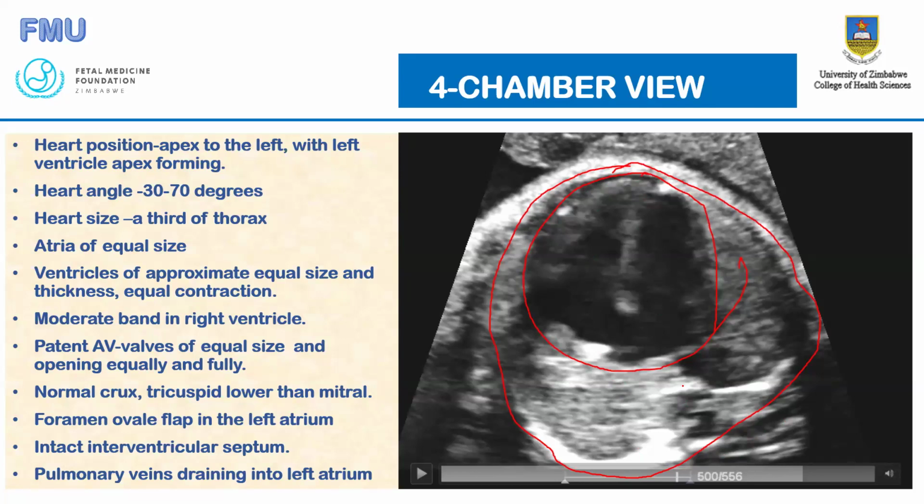But the interpretation always has to be in context. Sometimes you have a situation of small thoraxes. In cases of pulmonary hypoplasia, those women who come with anhydramnios or oligohydramnios early, they're going to have small lungs. So that's not a true cardiomegaly, because the heart looks big since it's appropriately grown and the thorax is small. So the thoracic circumference has to be within normal. There has to be nothing wrong with the bones, because you also see small thoraxes in cases of skeletal dysplasias, the achondroplasias and so forth. So always interpret it in context.